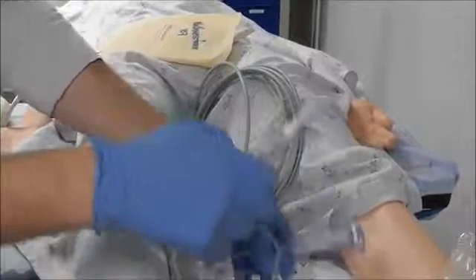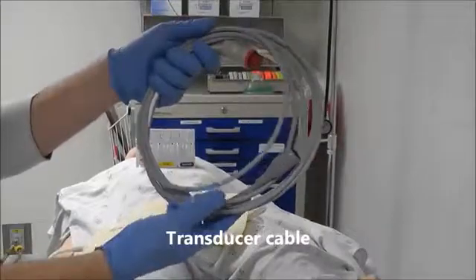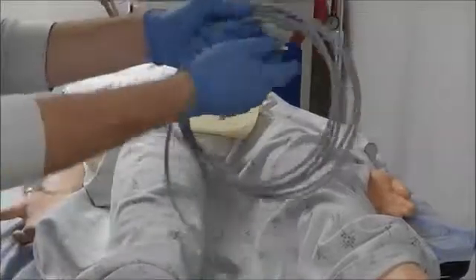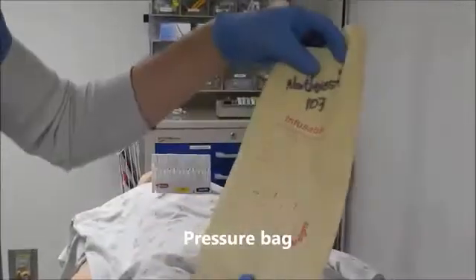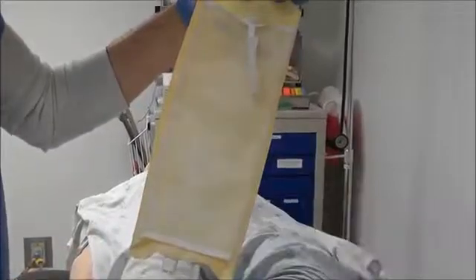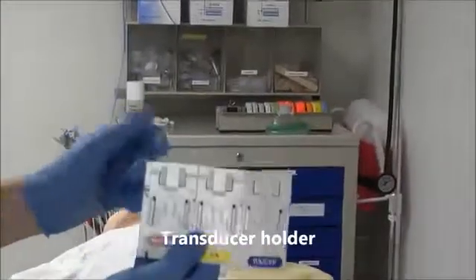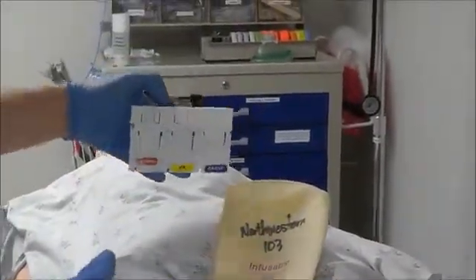So that's number two. Number three is you're going to need a transducer cable, because we're going to want to be able to hook this transducer tubing up to our monitor. The fourth thing is a pressure bag that will be able to pressurize this saline, so we can put this system under high pressure so we can flush the tubing. And then the last thing is something that will hold the transducer into place so that you can hold it at the level of the heart. So those are your materials, and now let's talk about how to set up.